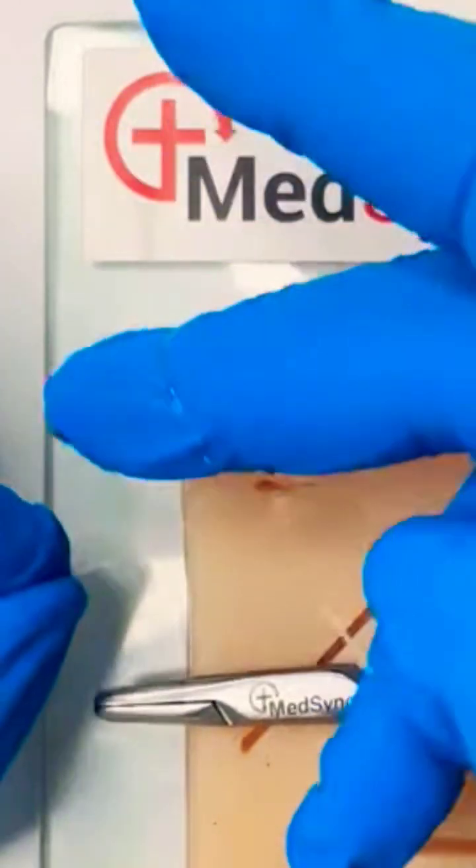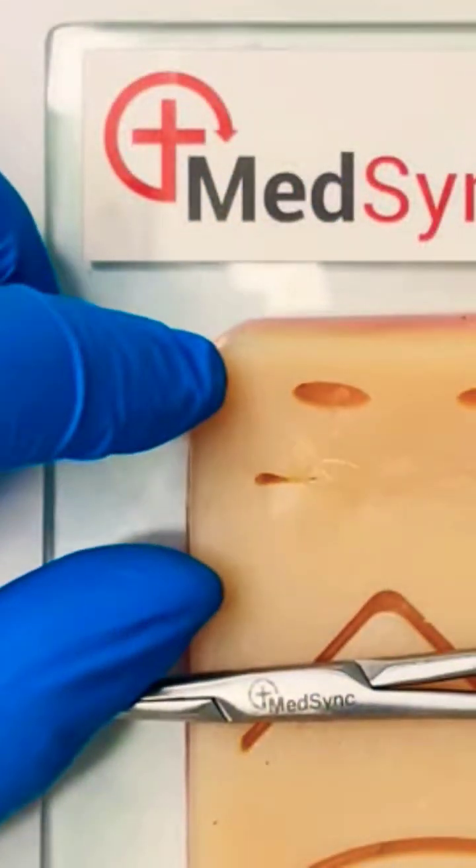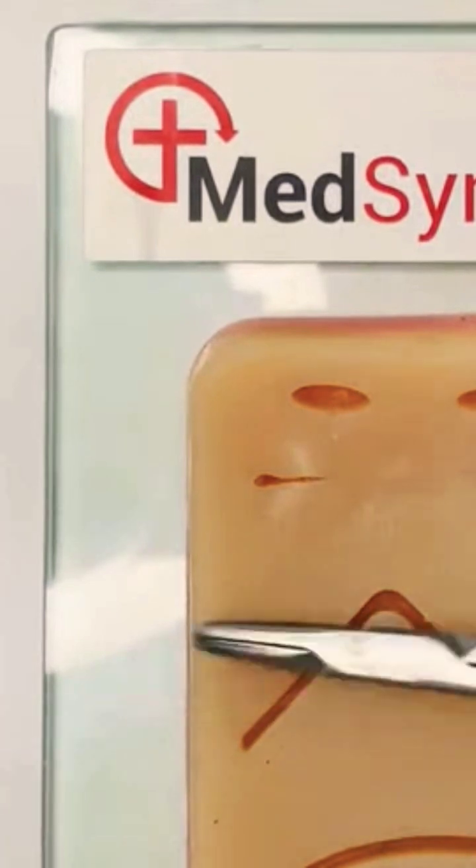Once the final knot is made, the needle is brought through the loop in its entirety.